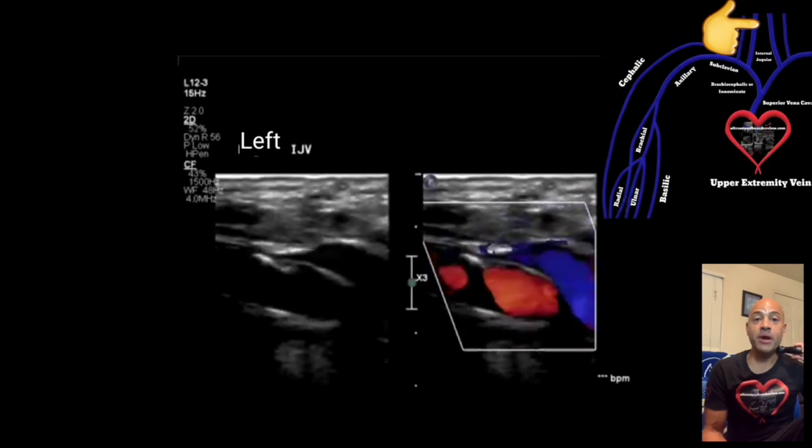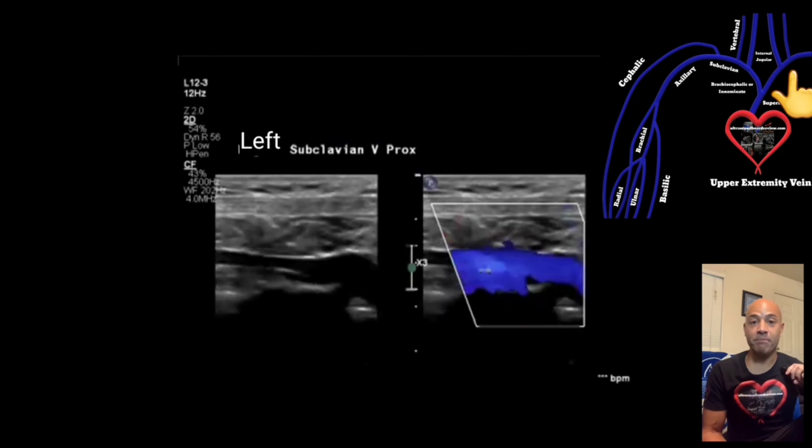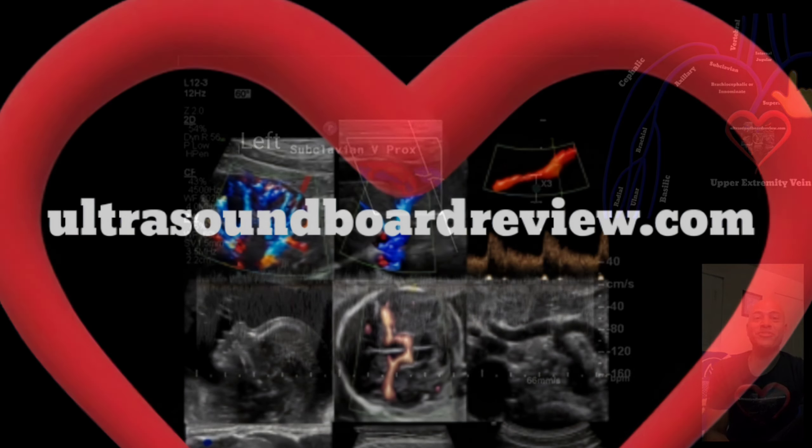Finally, you're going to evaluate the patient's contralateral side by assessing the internal jugular vein using the same protocol as before, and then examining the patient's subclavian vein. Thanks so much for watching — I'm with ultrasoundborderview.com.